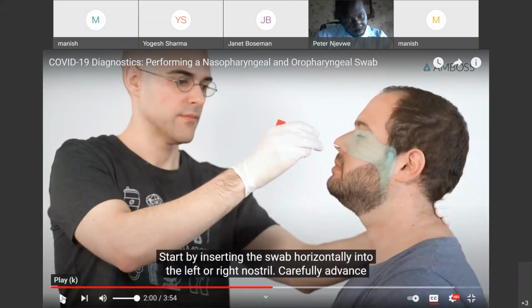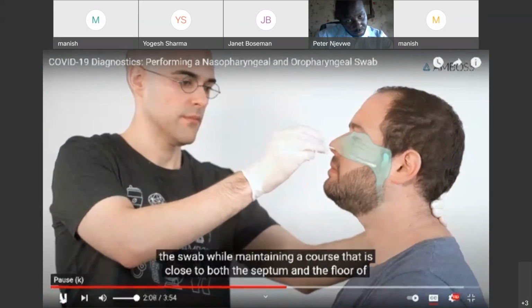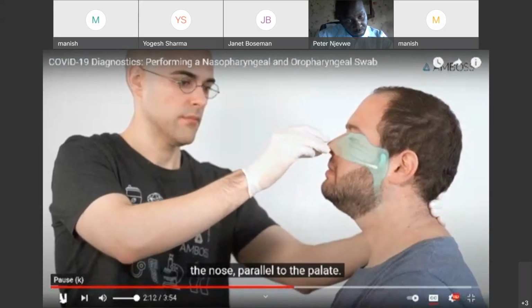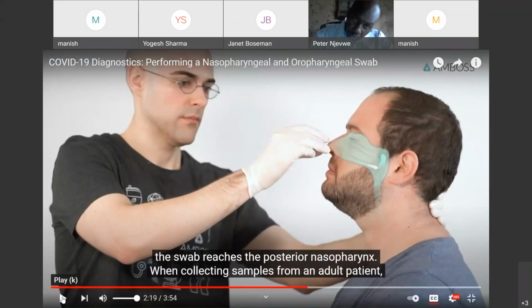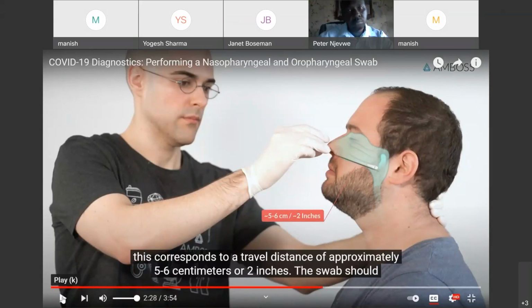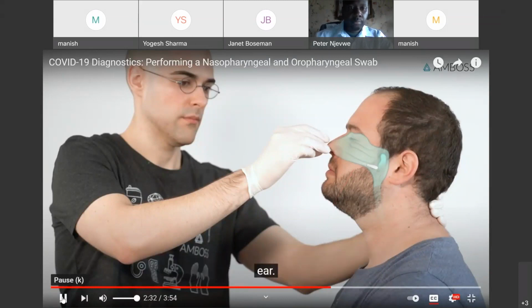Start by inserting the swab horizontally into the left or right nostril carefully, and carefully advance the swab while maintaining a course parallel to the palate, as I already explained in the guideline, as shown in the photograph. That much we have to insert the swab. It is approximately 5 to 6 centimeters or 2 inches, a depth equal to half of the distance between the nostril and the outer opening of the ear.